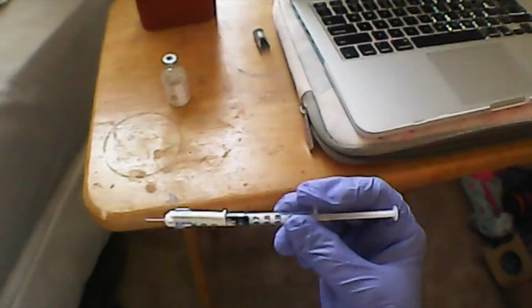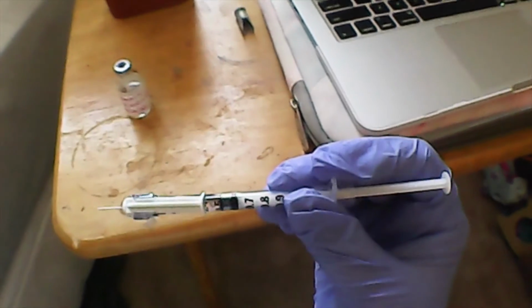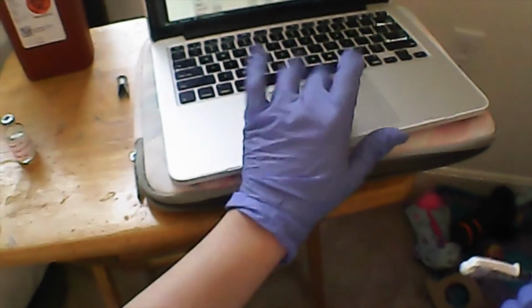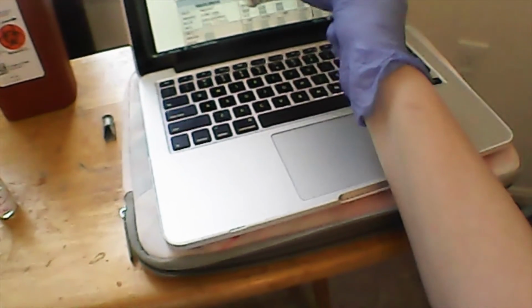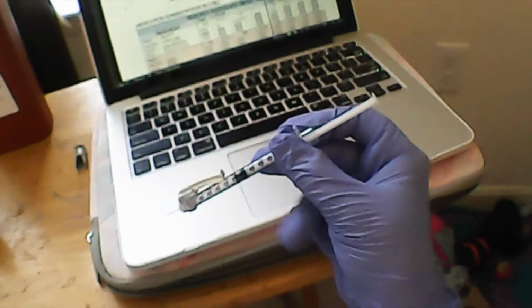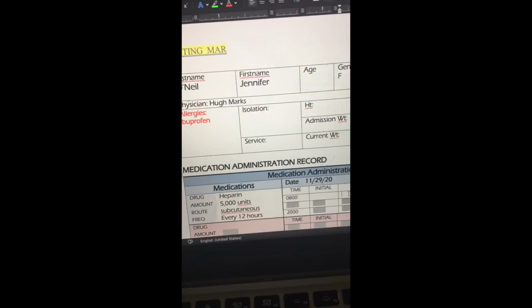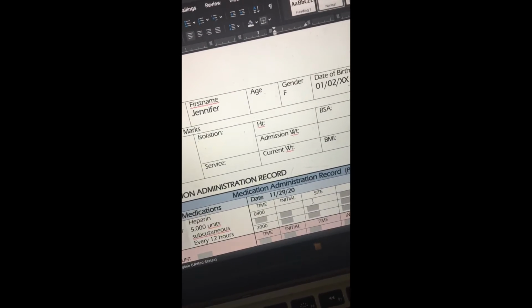Ding. All right, since I've just withdrawn my heparin into my syringe at 0.5 milliliters, we're inspecting for no air bubbles. We're also going to make sure that the needle itself is not bent in any way. I'm going to compare the medication I have just withdrawn for my third safety check to the MAR. So I have heparin, 5,000 units, subcutaneous, so 5,000 units is going to be given at 0.5 milliliters, and that is how much I have withdrawn in my syringe. All right, and before we administer, we checked hospital policy, and we realized that no aspiration is necessary.